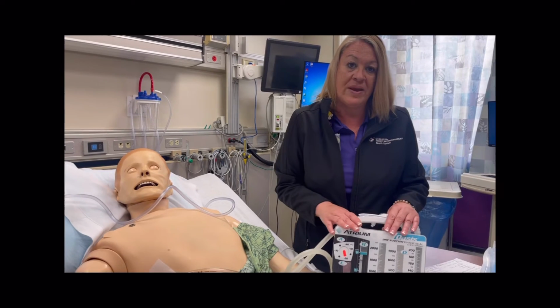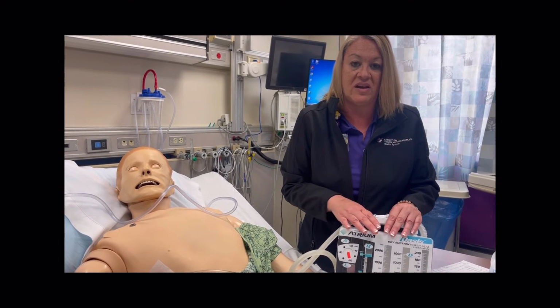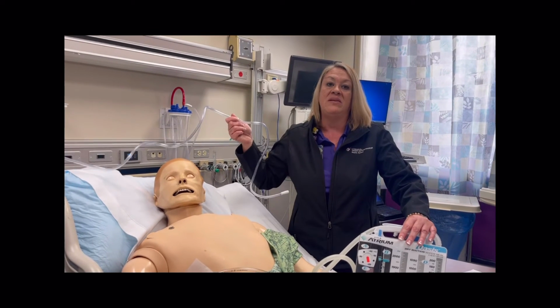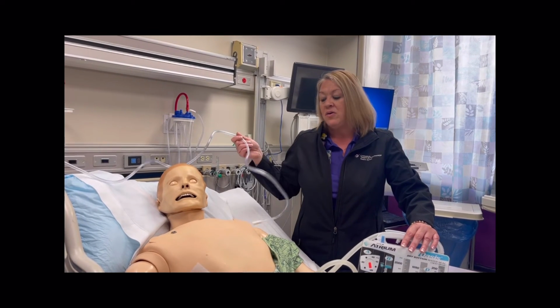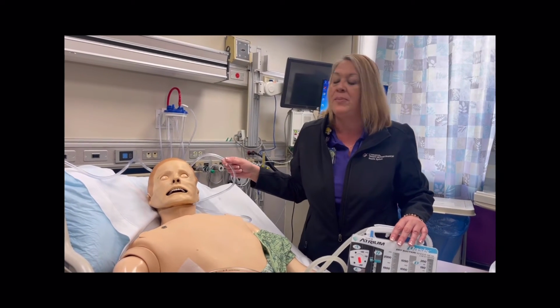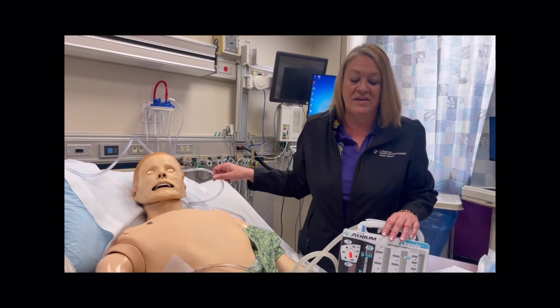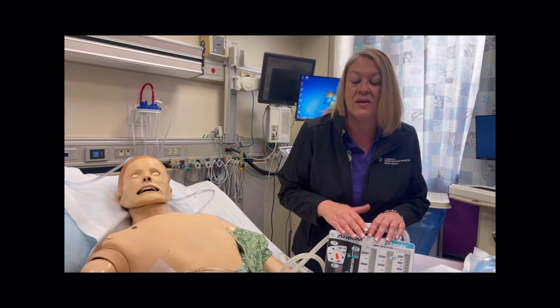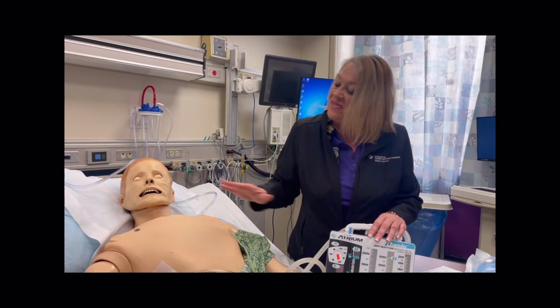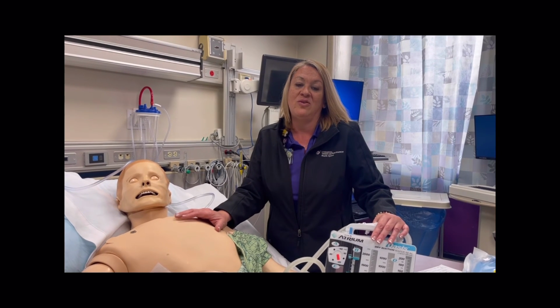Weaning, when the patient's weaning to water seal, of course, this is again on the floor. All of this suction setup has to be discarded. Otherwise, another one of your teammates could come in your room and think that somebody forgot to hook them up, or it inadvertently got disconnected, and they could reconnect it, and that would then interrupt or even ruin the weaning trial.